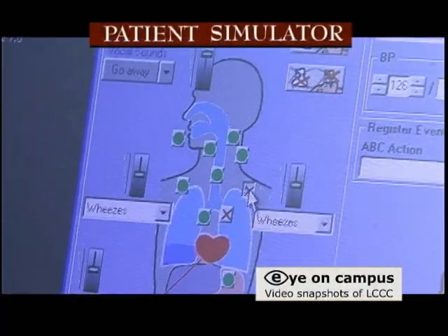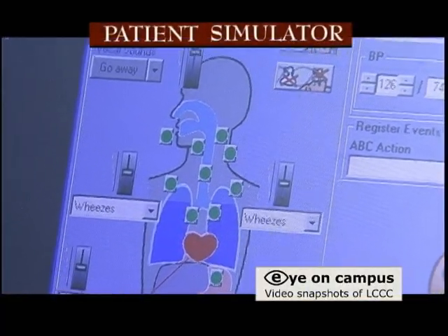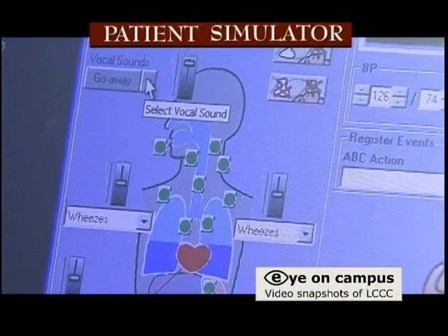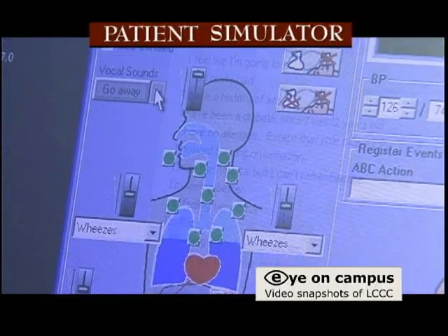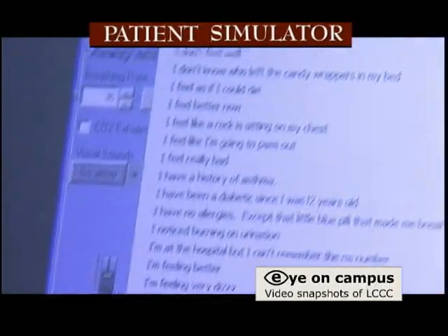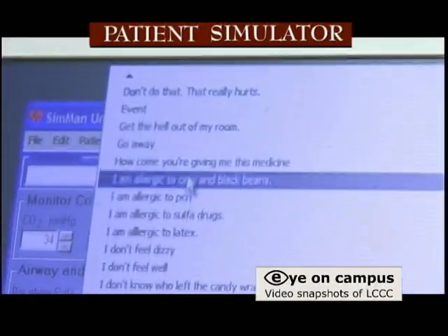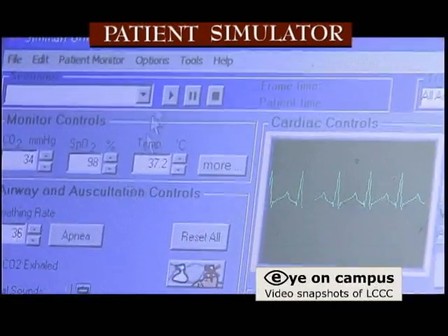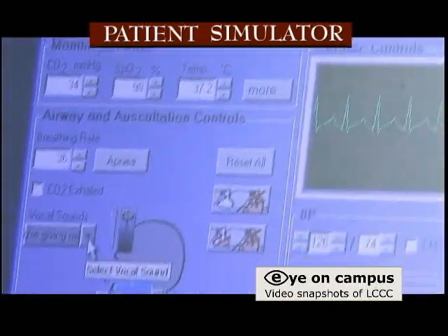A patient simulator is a computerized patient, and it allows us to have a patient that breathes and talks and does things for the students to practice.